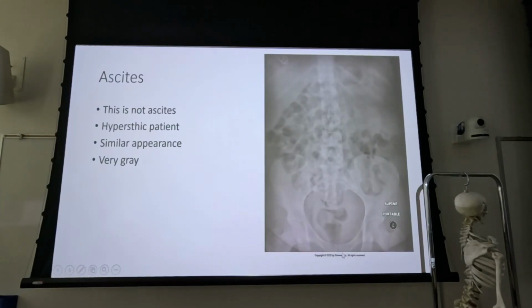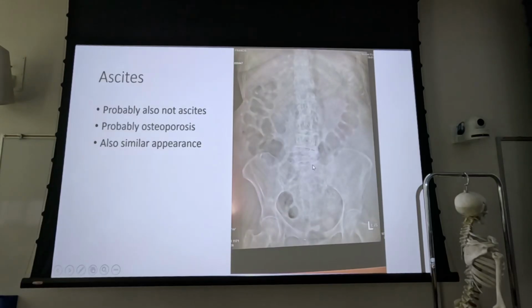You can see there's a soft tissue roll there. I bet this patient is quite large, and yet they position. If they could find the iliac crest on this patient, you can find the iliac crest, okay? So find the iliac crest, position at the iliac crest. Also, though, if you look at this patient, you got a lot of soft tissue out here, but look in here, and we got direct exposure, and I'm not knocking their collimation here, because how do you collimate to this body shape?